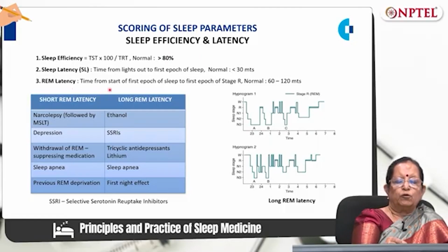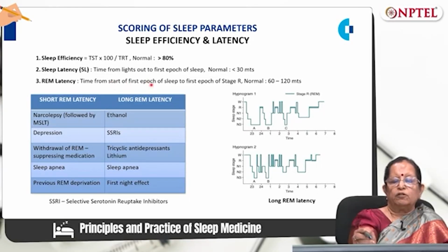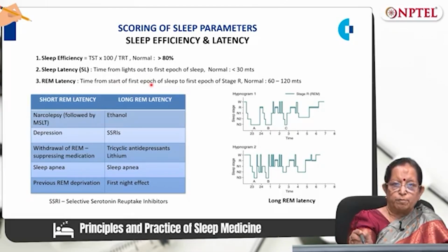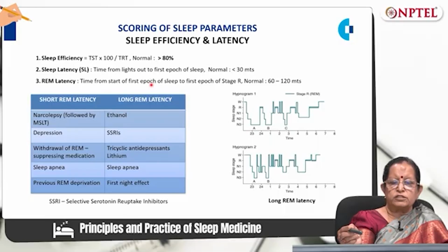Sleep latency, I told you, is the time from lights out to the first epoch of sleep. Normally, that is less than 30 minutes. That means we will be sleeping. When you go to bed, you are supposed to reach the first stage within 30 minutes.